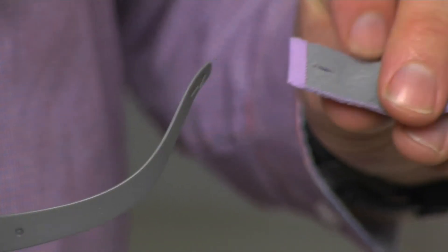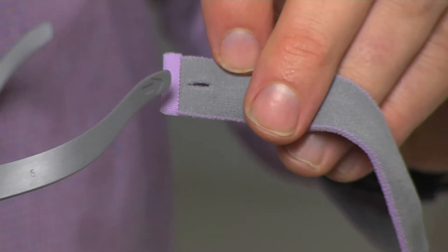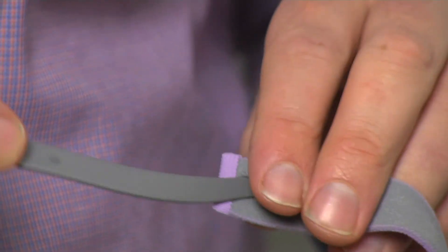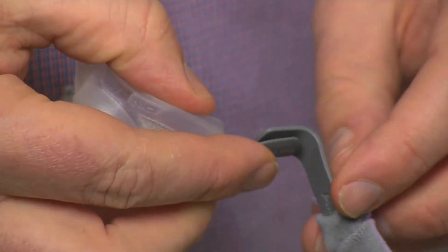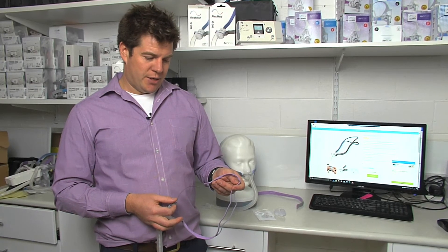So whether you've just finished cleaning your mask accessories or you've just received our new accessory package, the next step is to put the mask back together. The first step is to find the slit in the headgear and then slide the frame into that — it can be a little bit tricky. Slide it in and then slide it over the connection point here in the frame, and then repeat on the other side of the mask.